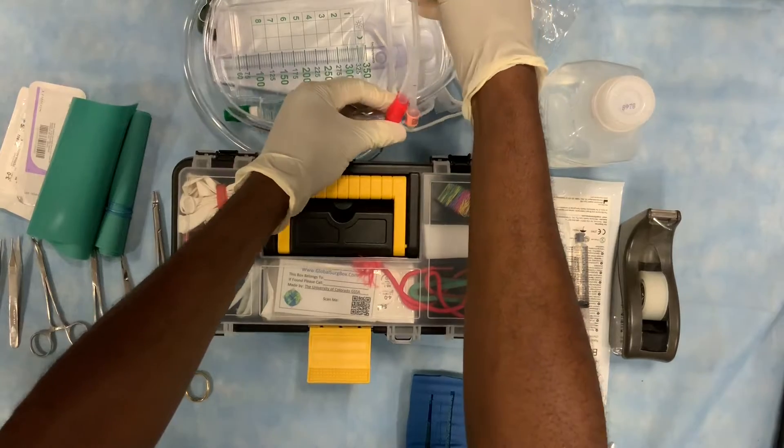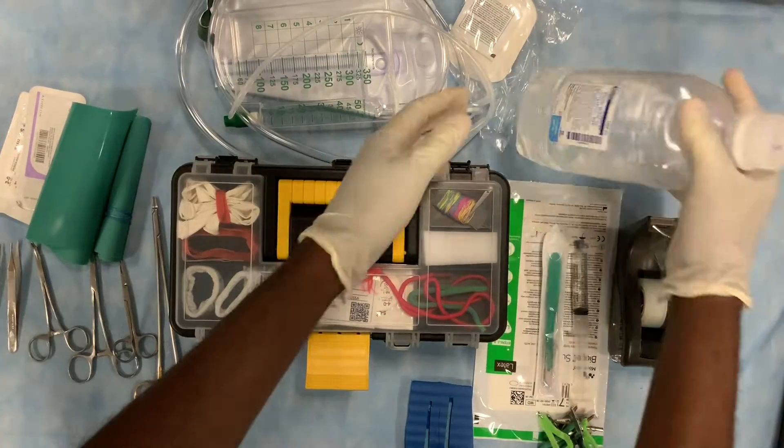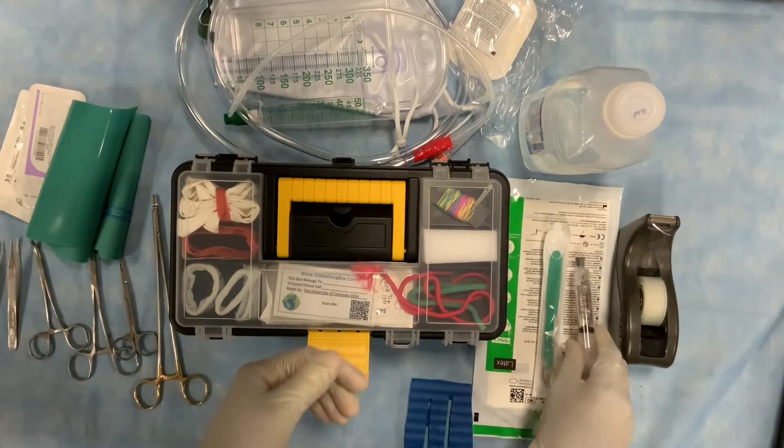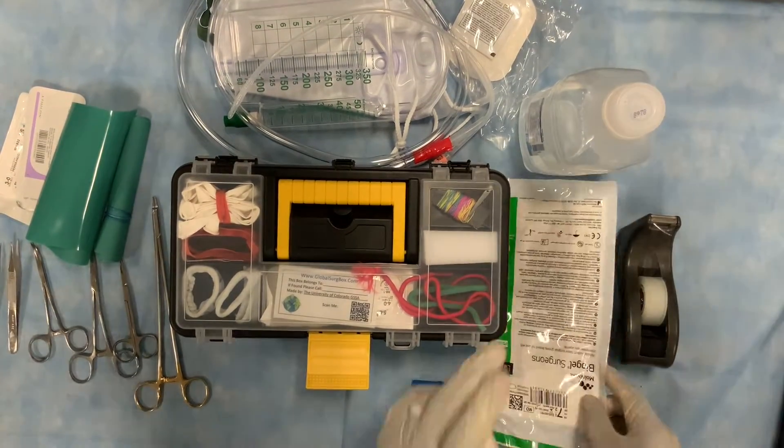Outside of the box, you will need a Foley catheter of any kind with a urine bag, tap water or any kind of saline or other liquid, a needle and syringe, a scalpel, a pair of gloves, and some tape.